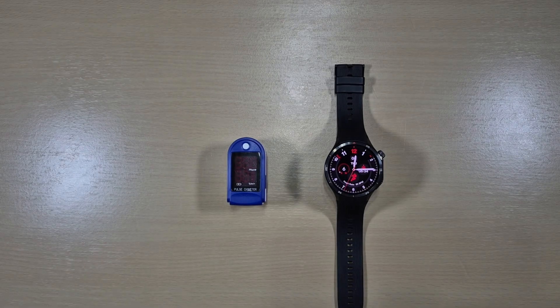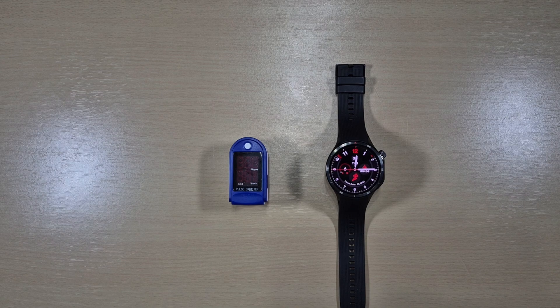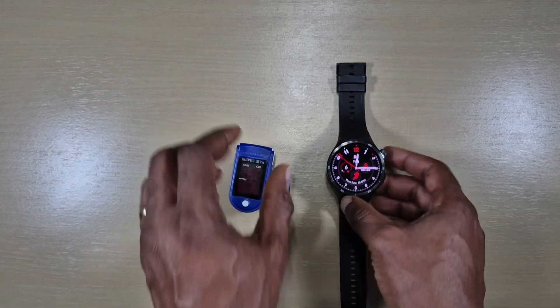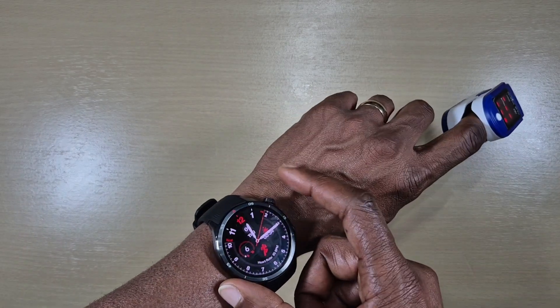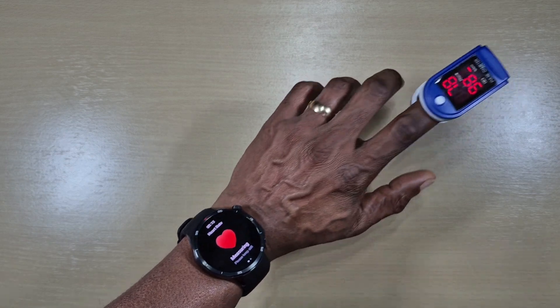Welcome back to another video. In this one we've got the OnePlus Watch Free and a pulse oximeter. We'll be comparing the two for heart rate readings to see how close the OnePlus Watch Free is to the actual meter. First off, let's put the watch on, make sure it's nice and snug, put the meter on, go to heart rate measure, and stay still.